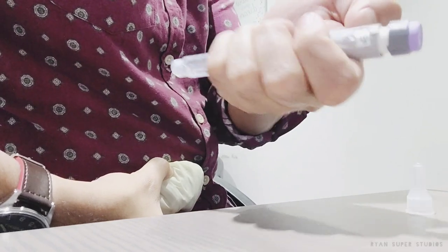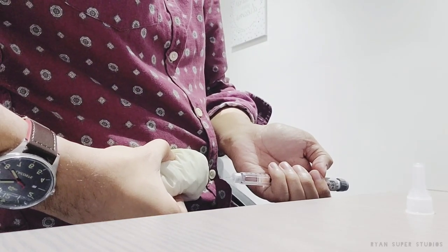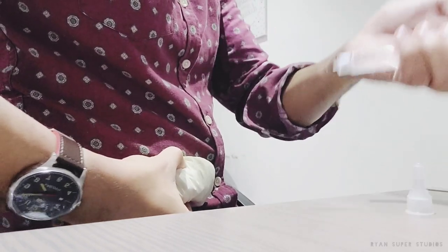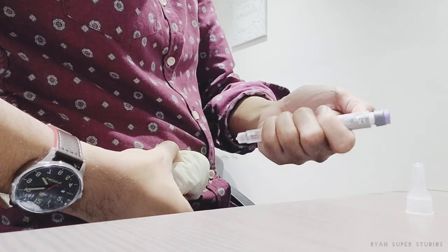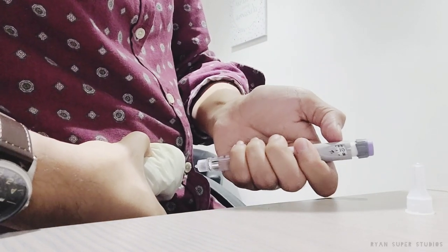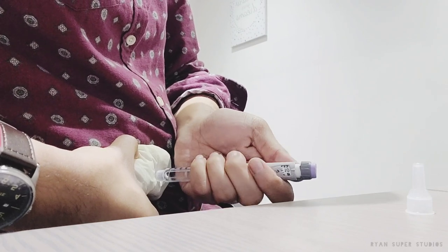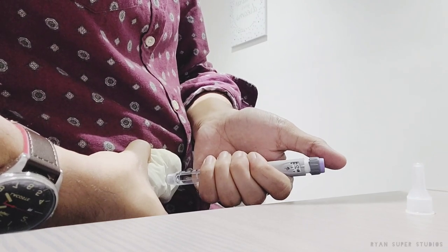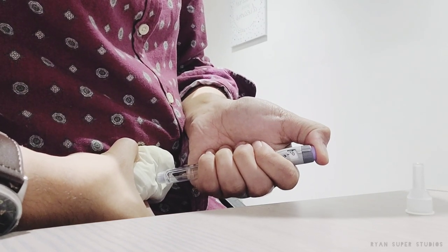Let the window face you so you can see what's happening. Previously you needed to inject at an angle because needles were bigger, but because this needle is fine and small, you just inject it straight — no angle needed. You can see number 10 in the window; just inject straight, keep pressing the pen against your skin, and slowly inject until the number zero appears.